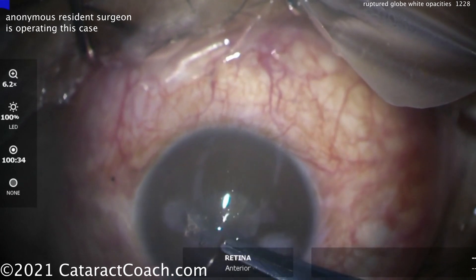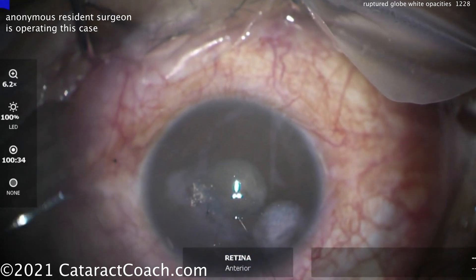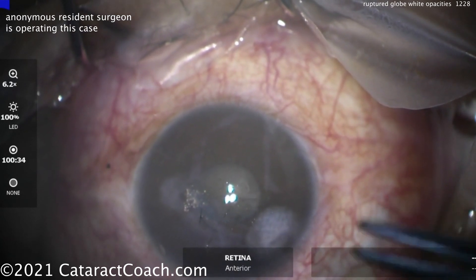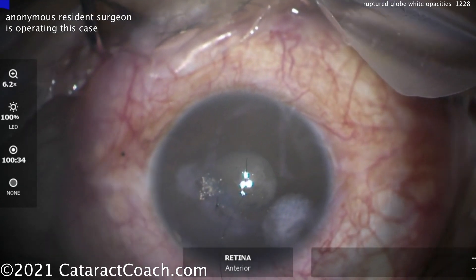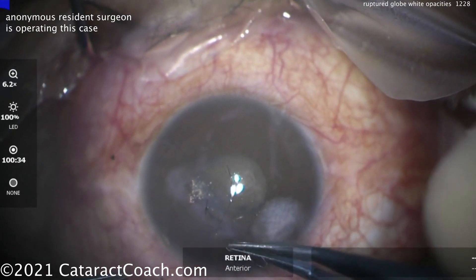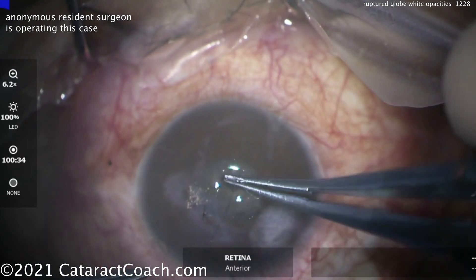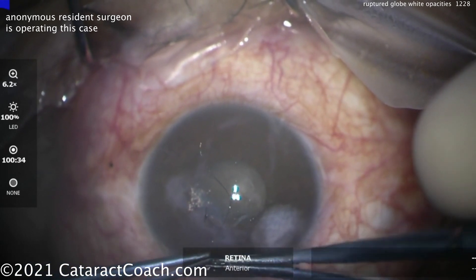The first step is to close the corneal laceration. The resident is doing that with 10-0 nylon sutures. Not the best video quality or centration, but it's what we have. The key is to ensure a nice watertight closure of the incision. You don't want to pass the suture through many times — do it as few times as possible so you don't chew up that corneal tissue.